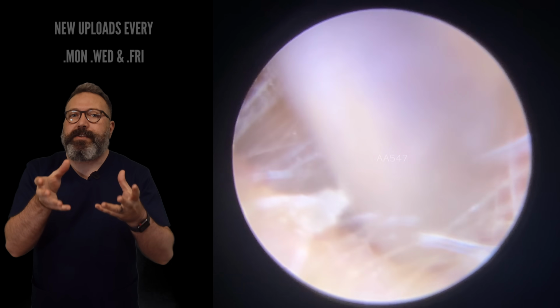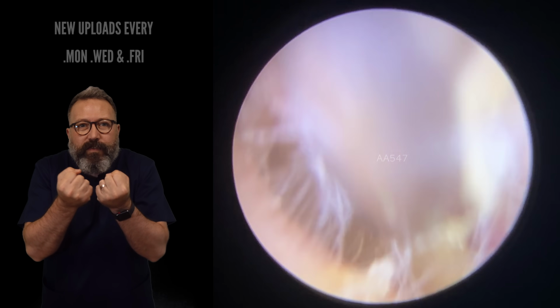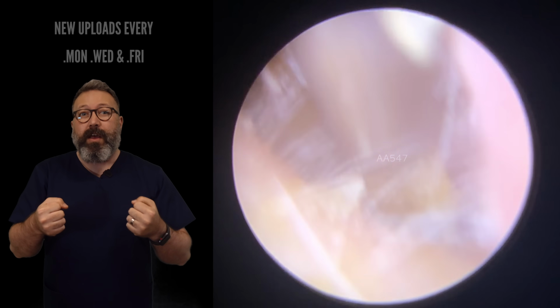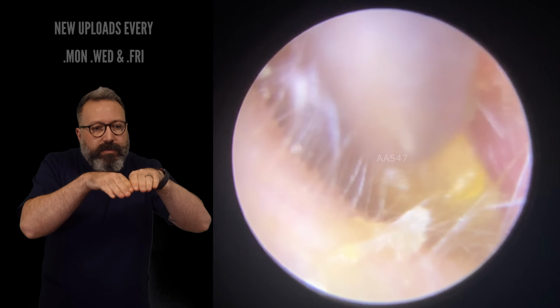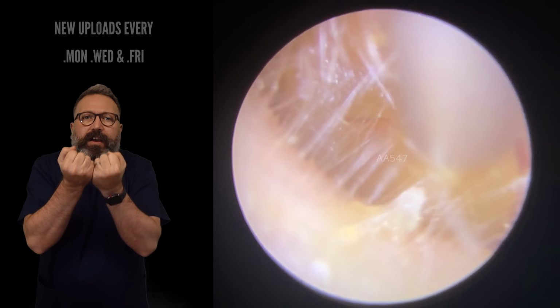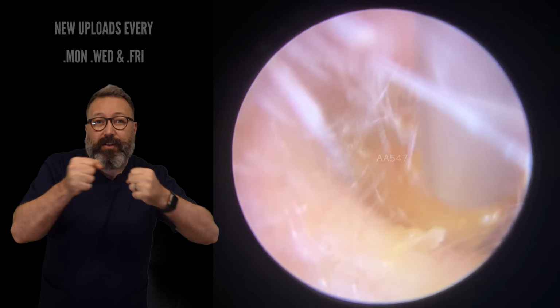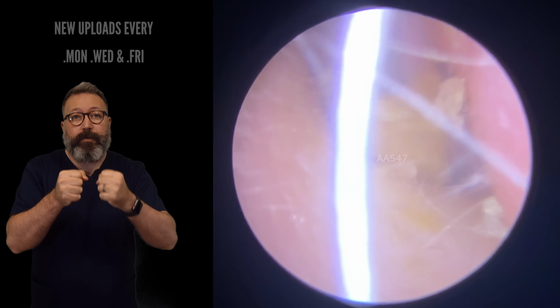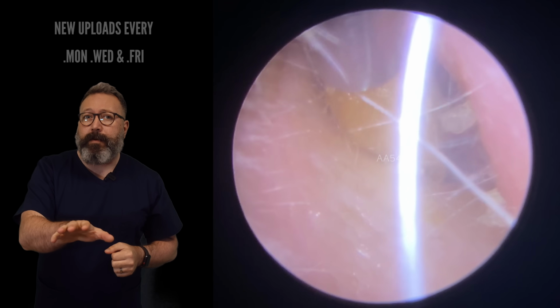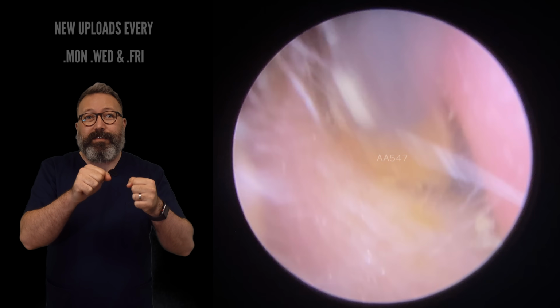So now you'll see the skin, the oiled skin, if you like. So look how tough this is. I'm really having to fight this to get it off the ear canal wall because it dries. You imagine it's detached from the layer underneath, so that surface layer then becomes much tougher and drier. It hardens, goes like a leather, and we're really having to kind of wiggle this back and forth to get this out. So a lot of wiggling. Be warned guys, there is some turbo wiggling coming up in a second. So you can see I'm really fighting it, and there we go, look at that.